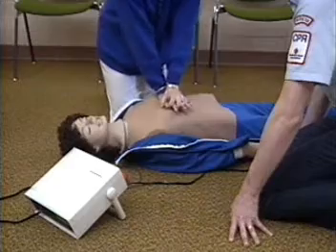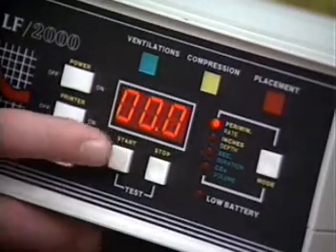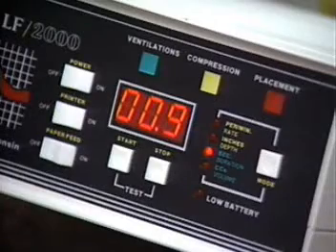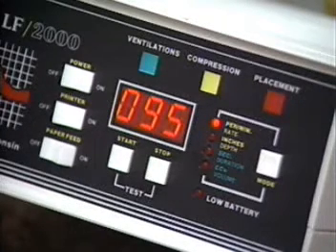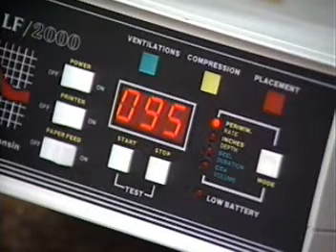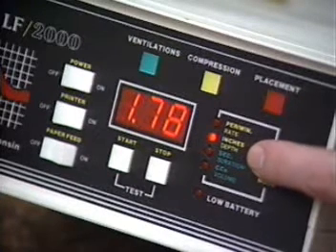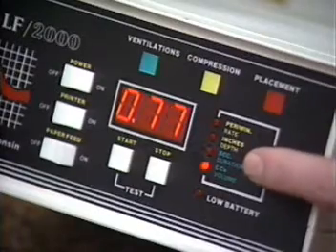For an overall evaluation, a performance test can be run using the electronic monitor by simply pressing start and beginning the CPR sequence. Each compression and ventilation is displayed separately, one at a time, on the digital display screen. Press stop to end the testing sequence. Each of the performance modes is automatically averaged for all of the cycles completed. When scanning through the different modes, you can determine the overall compression rate per minute, compression depth in inches, ventilation duration in seconds, and ventilation volume in cubic centimeters.